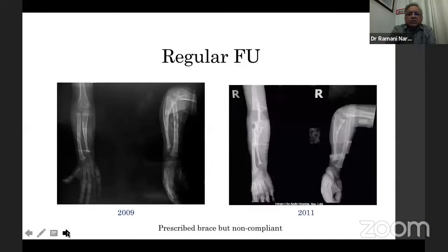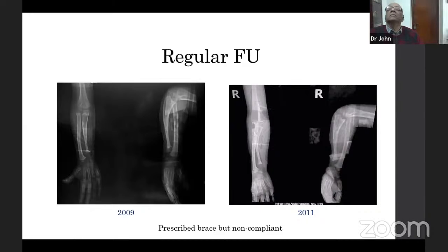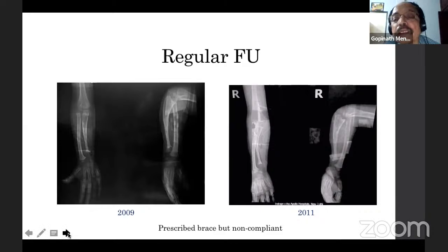Now this is in a prescribed brace, but non-compliant. You see this now, again, the radial head is going out. So Dr. Gopinath, what do you think you should do now? Yeah, now, of course, the ulna is pretty shortened. That is the reason why the radial head is getting dislocated. So we need to lengthen the ulna, probably. Would you do it?